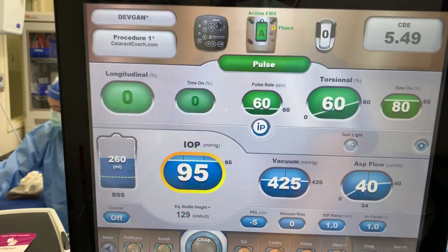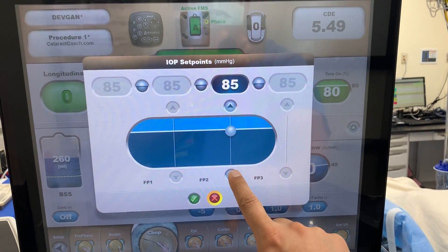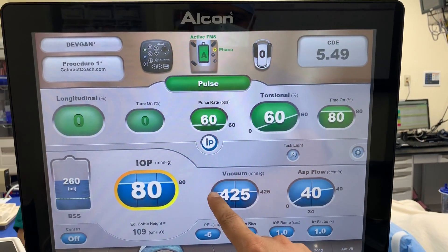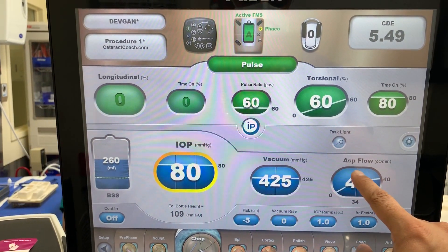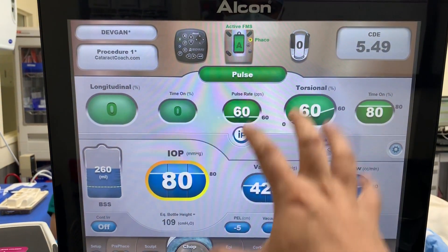The fluidics is just enough to aspirate the material. For chop, though, now we need to adjust fluidics. We need more inflow, higher infusion pressure, higher bottle height. You need a much higher vacuum — so this is 425 millimeters of mercury — and a quickly ramping up aspiration flow rate. So it ramps up to 34 and then flattens out to 40.